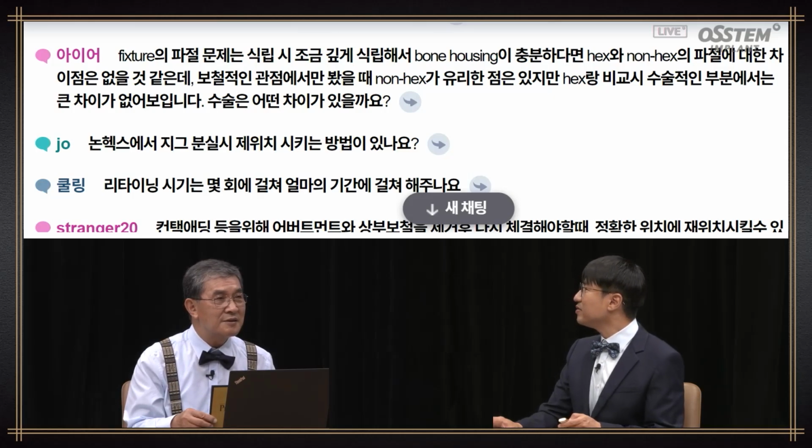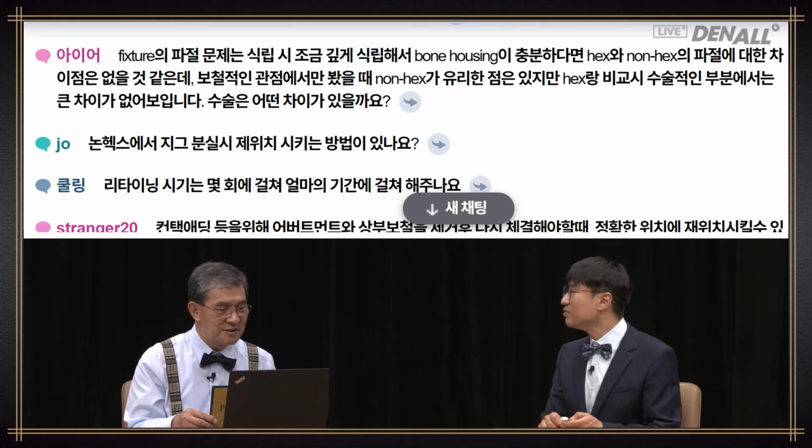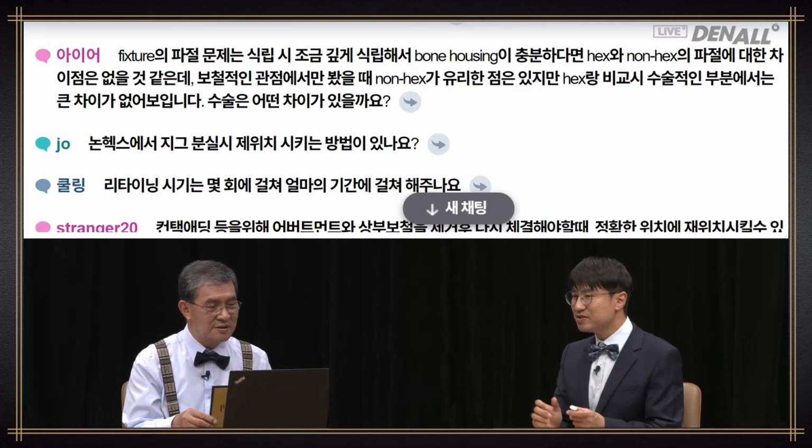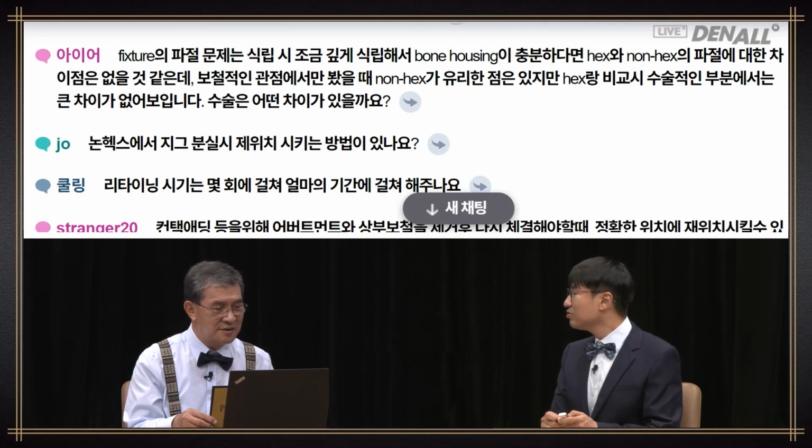I think non-hex implants have more resistance against implant fracture. First, there's no residual area that occurs upon hex processing. There's no research data. Also, the fixture diameter is more attractive. Doing surgery is quite inconvenient, but by using a smaller diameter, you can make bone grafting easier.